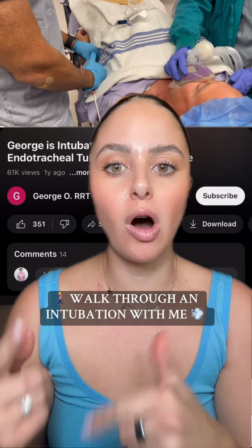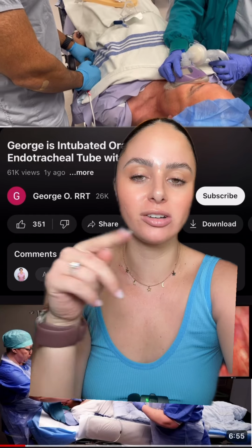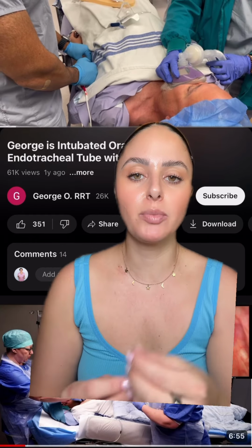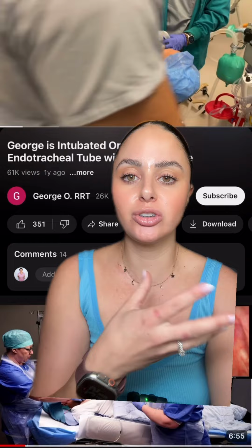I want to walk through all the steps of an intubation with you guys. Also, I got this video from George ORRT on YouTube. Intubating someone is where we put an endotracheal tube down a patient's airway and connect it to a ventilator in order to assist the patient in breathing.